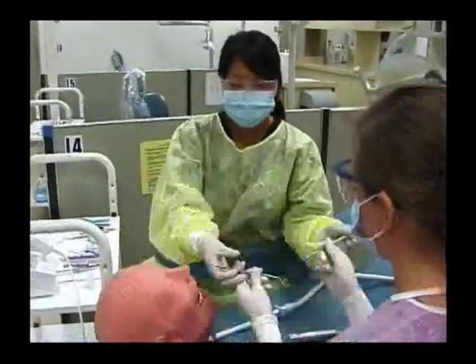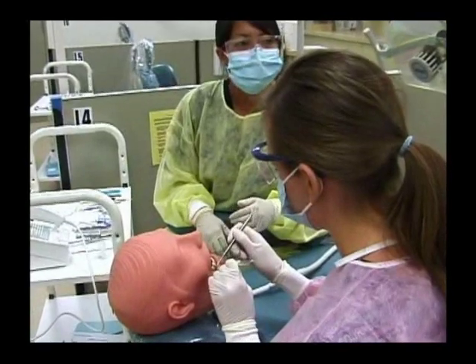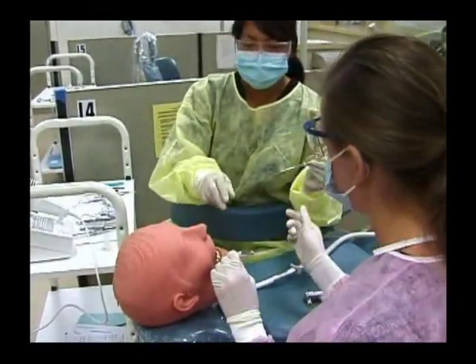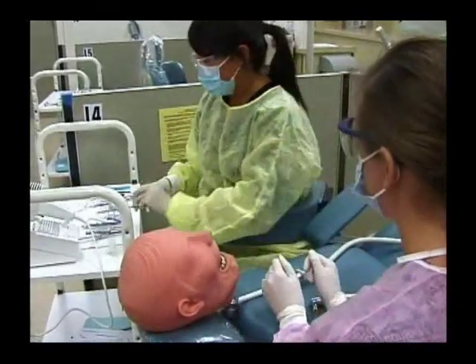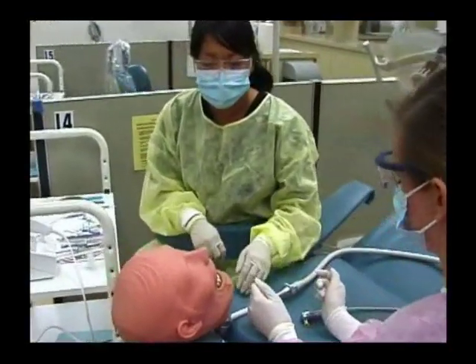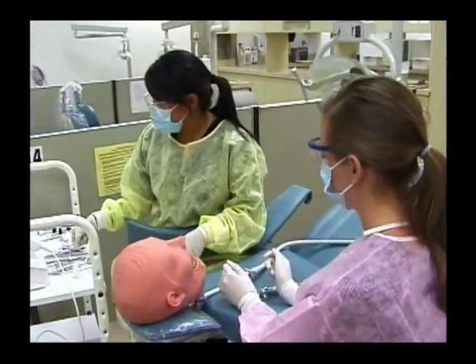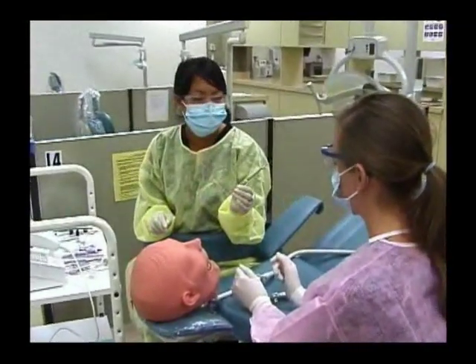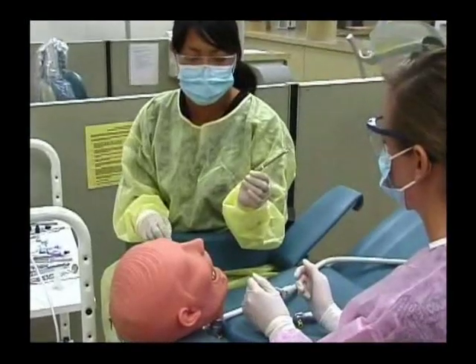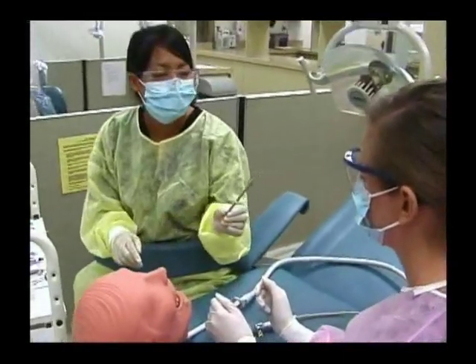Then you'd hand the doctor the instruments. The doctor would use a high speed handpiece and burrs to prepare the tooth for the restoration. Some other instruments she may use are a spoon excavator to carve out the decay, or enamel cutting instruments.